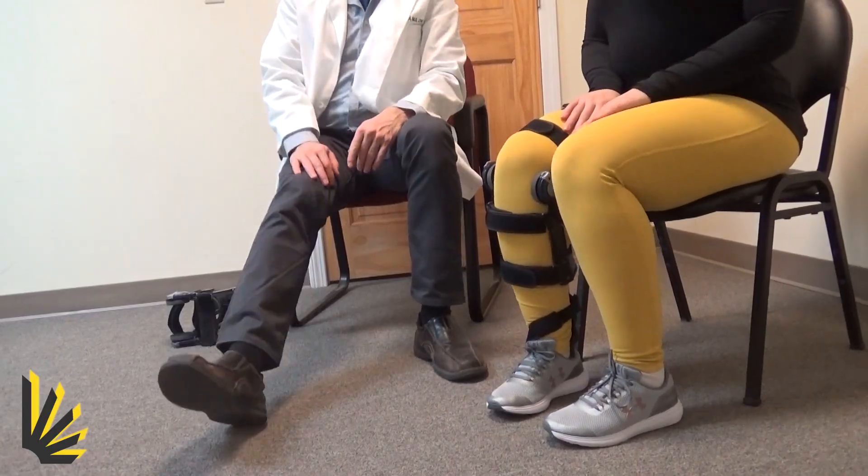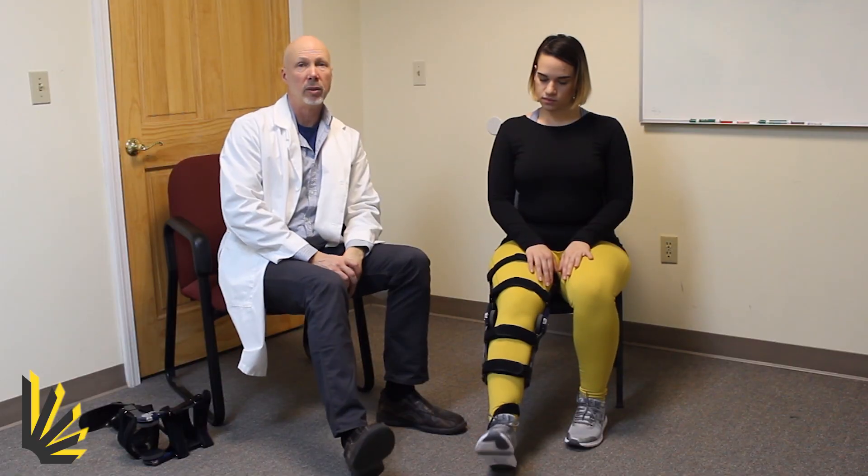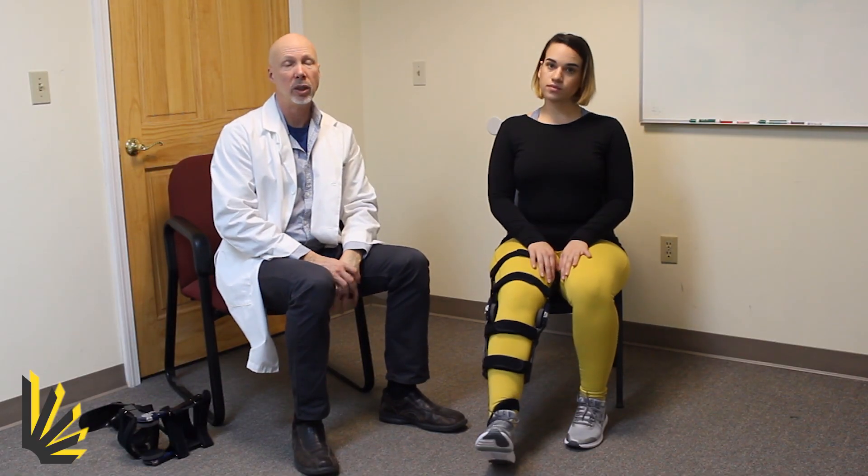You'll notice that the foot section — go ahead and move your foot — gives you full range of motion both in the coronal and the sagittal plane. So there's no restriction to her ankle motion either way.